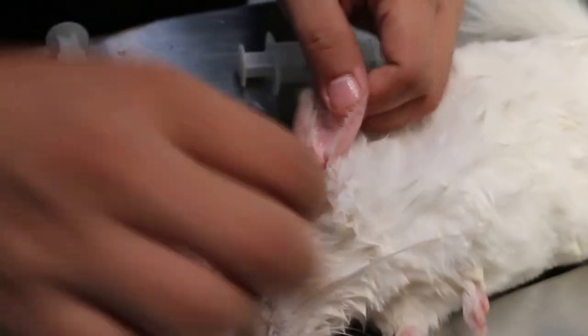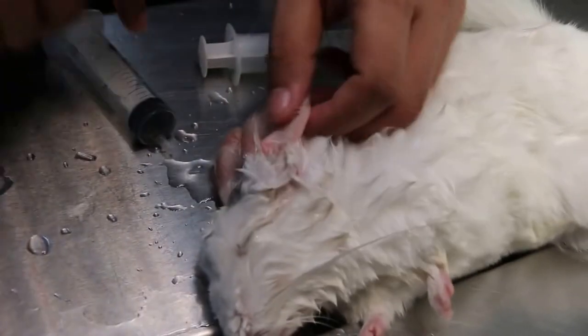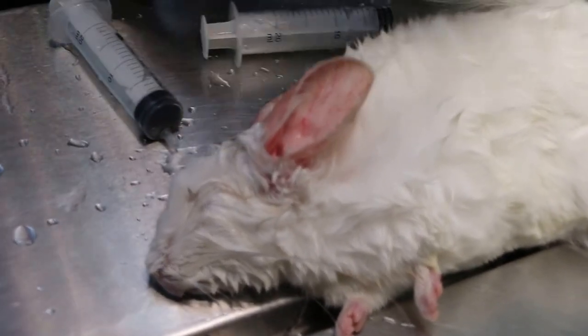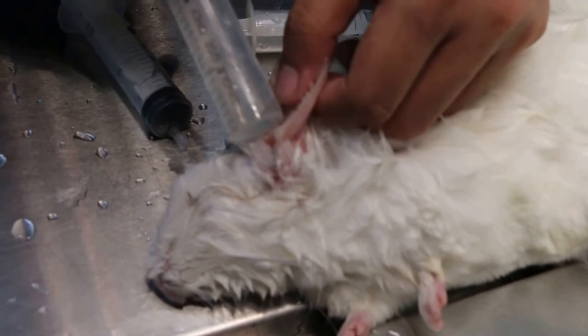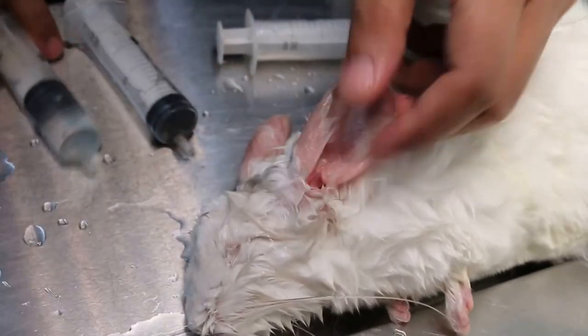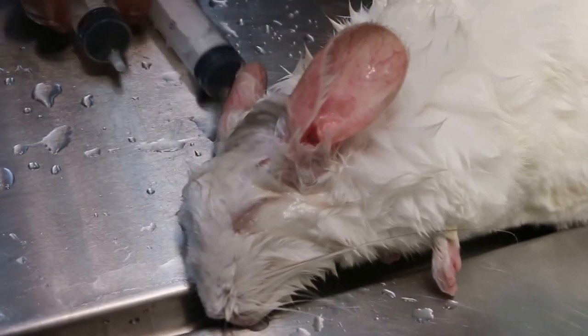But his problem is the right ear. Okay, so don't put anything in. So if the wax is affecting the ear drum, then we try and clear the wax. But the owner has given ear drops from the other vet for over a week. Okay, finish it.